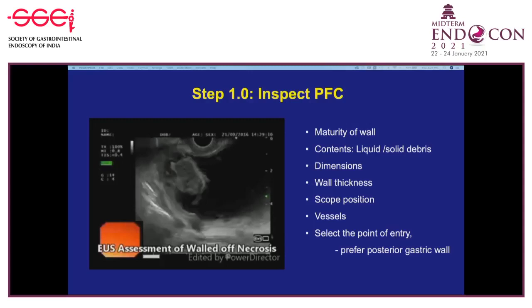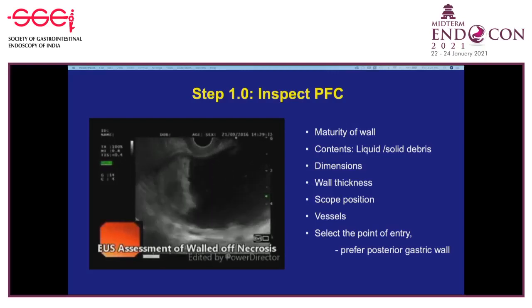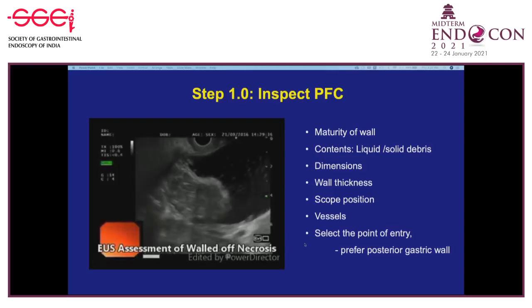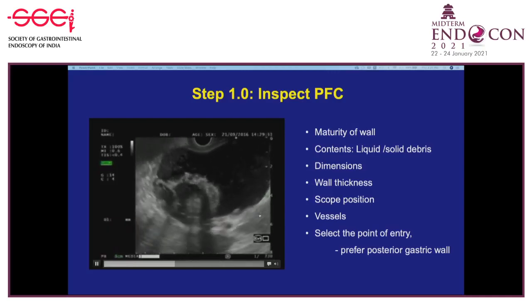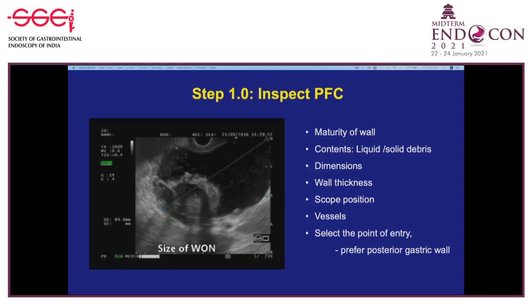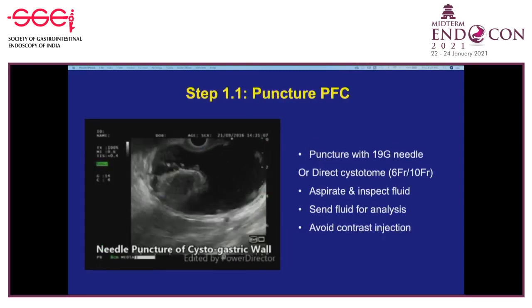If going from the stomach, it is always preferred to use the posterior wall so it goes directly into the lesser sac. Hitting anteriorly on the stomach carries a risk of perforation. The variable amount of debris means you have to make an overall assessment. Measurements should use two perpendicular lines—that gives a pure measurement in two dimensions.